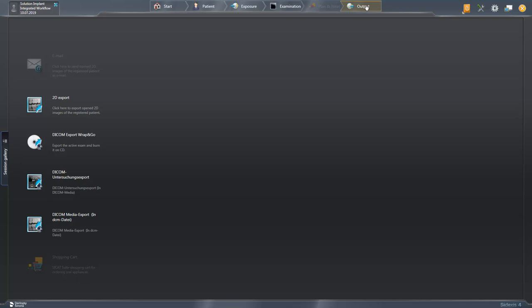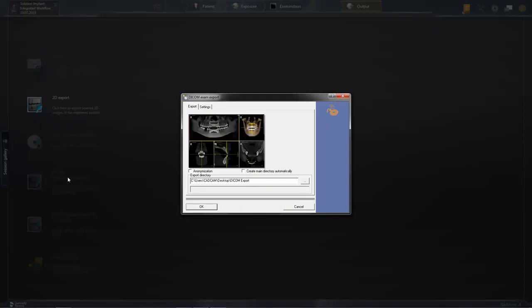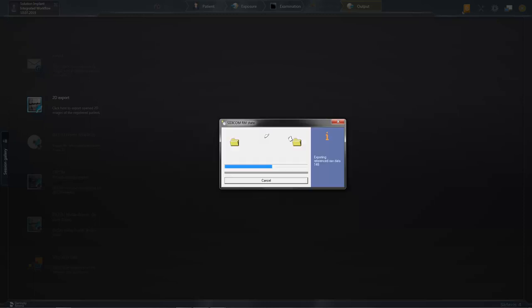We start with the option DICOM Examination Export. First, the DICOM Examination Export menu opens in which you can specify the storage directory. Setting a checkmark under Anonymization means that the export is carried out without patient data. We then confirm with OK and the DICOM Export is started.